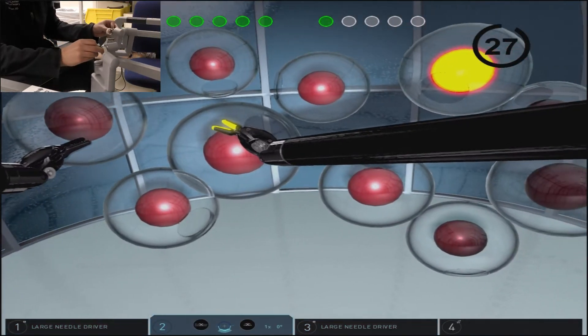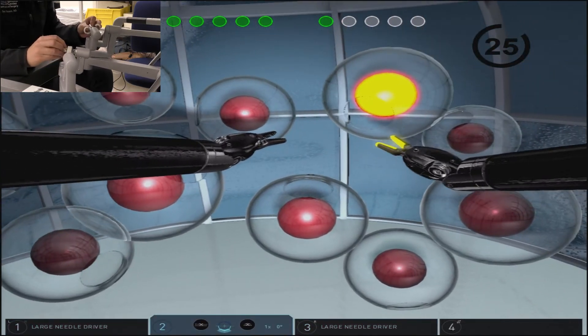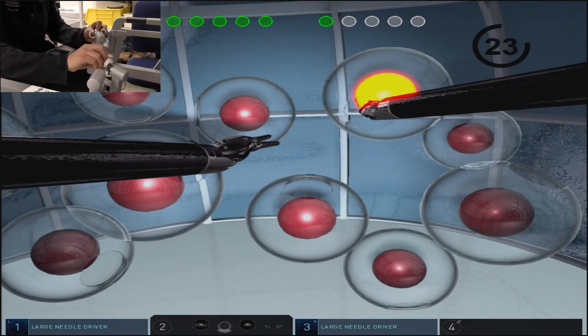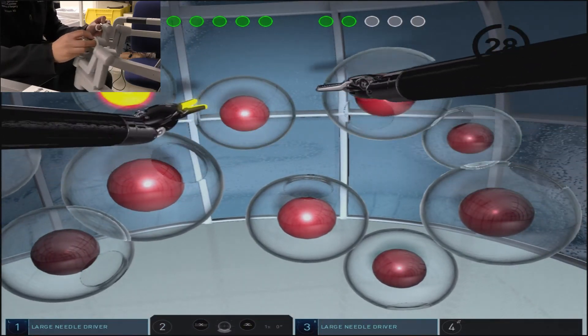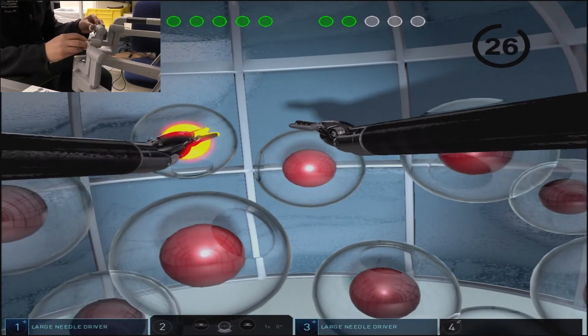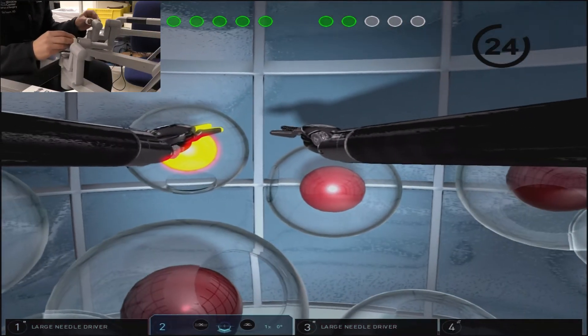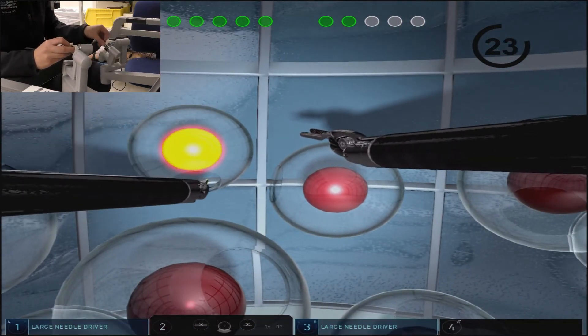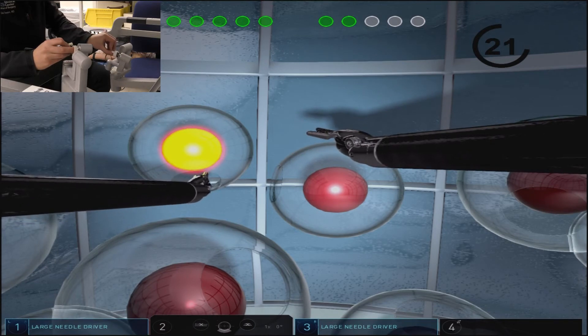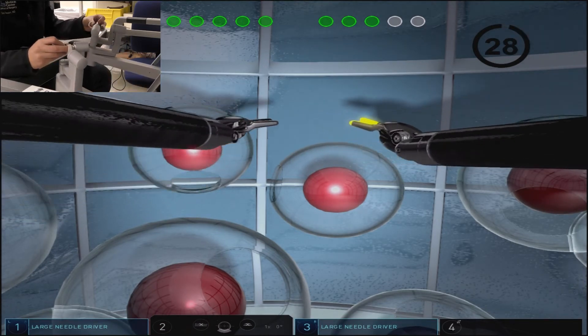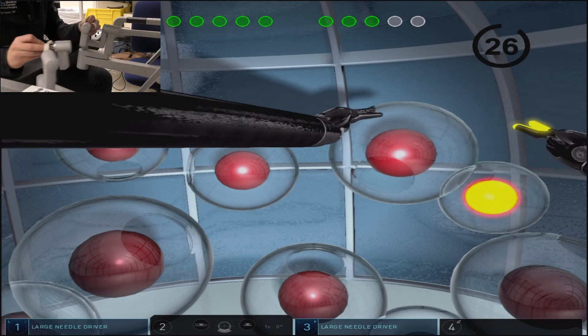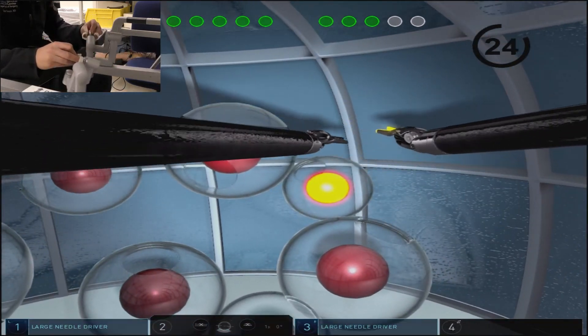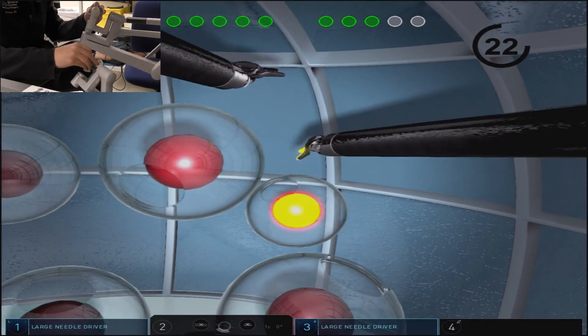As mentioned in the wrist articulation 1 video, by using the hand controls to straighten out the instrument tips as you enter through the glass opening, this allows you to touch the inner sphere while the remainder of the instrument avoids contact with the glass edges or the external pressure on the globe.